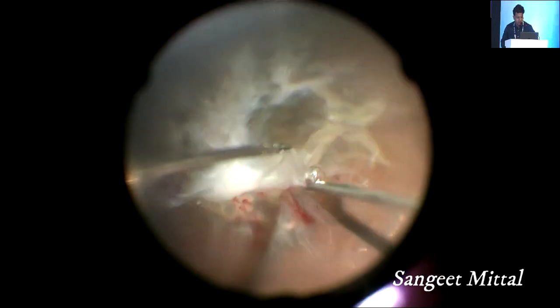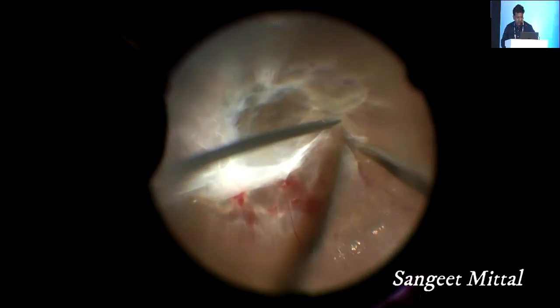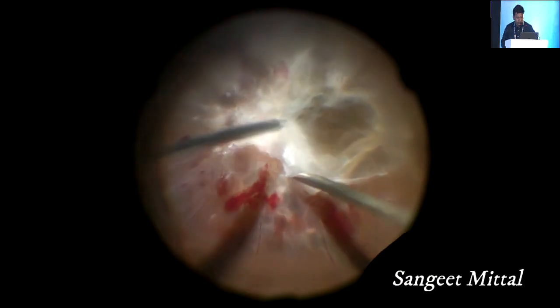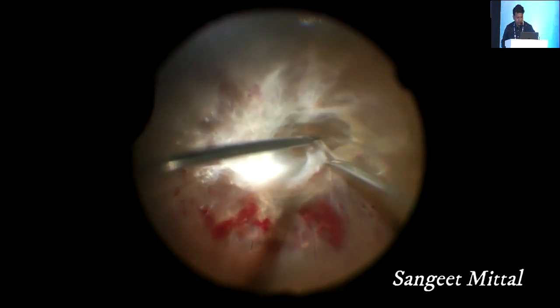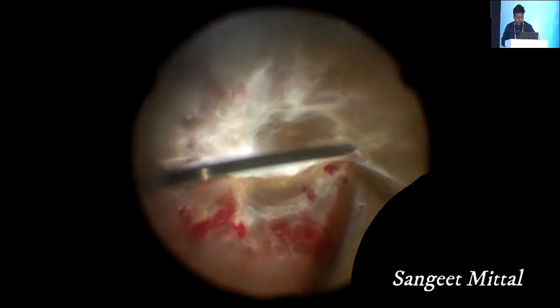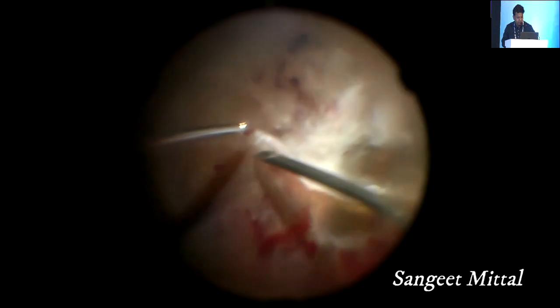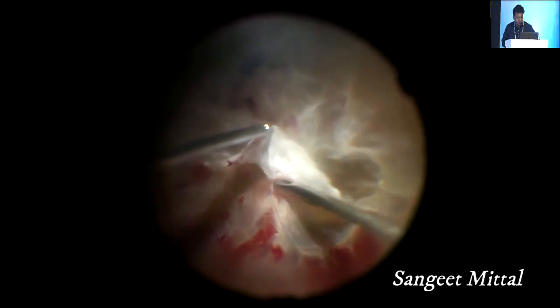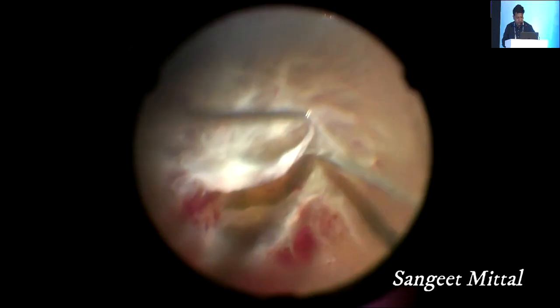For my way, I am using a longer 1-inch 25 gauge needle. And you can just hold up the membrane, and with this needle, you can cut at the vascular epicenters. Similarly, this can be used to delaminate the membrane as well. So one by one, all these vascular epicenters were removed. And once you reach the optic disc, you can now remove the membrane from the optic disc and proceed further with your vitreous cutter or with the scissors if you may like.